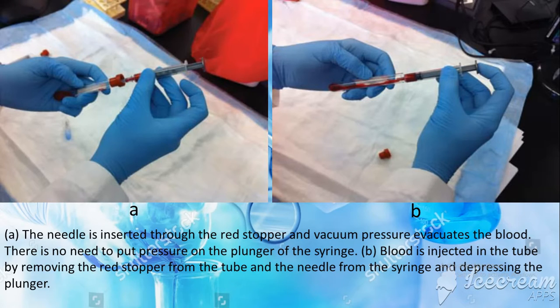In the first picture, they explain when you use needles with the tube with vacuum. We don't want to push the plunger of the syringe. But here, if we remove the cap of the tube, we should use a special technique to inject the blood.